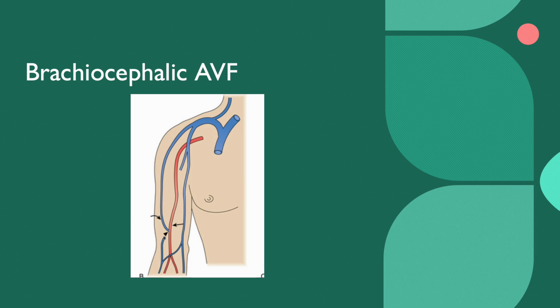So it's really important when you're doing the vein map, you have light pressure on these veins. You know they're very close to the skin. You want to make sure you're measuring the correct vein, all these things, so you can give the patient the best option.